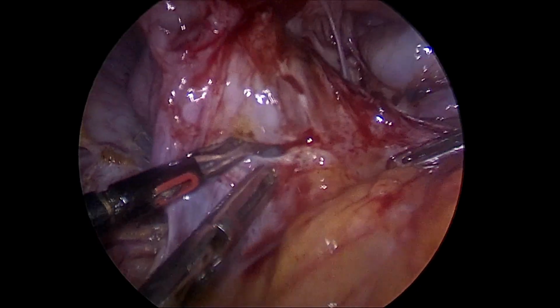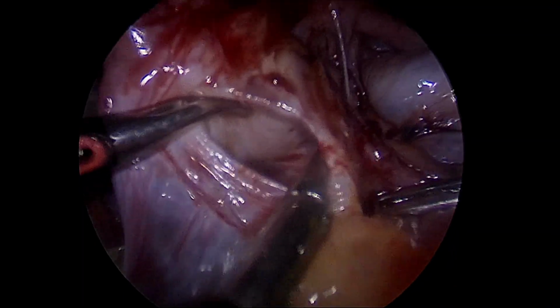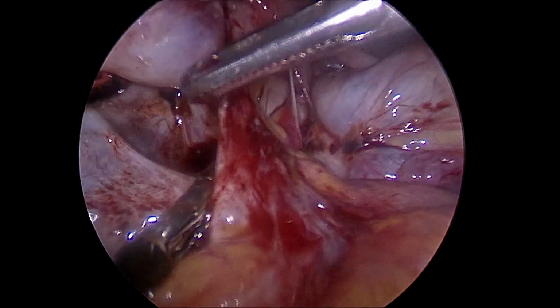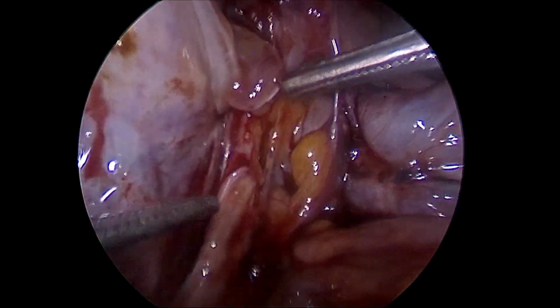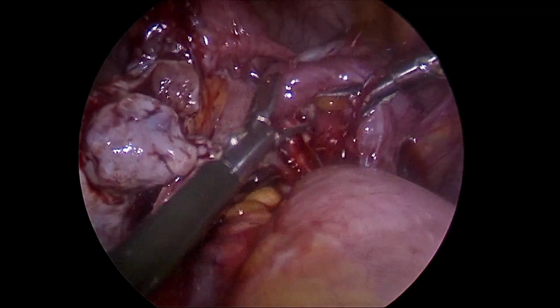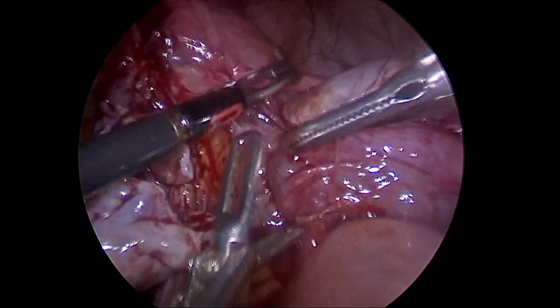As we see, after separating the bowel from the lateral pelvic wall, we go to the region of the left tube and the ovary where we find the natural windows through which we do a blunt dissection and separate. When the left ovary was separated, we can see hemorrhagic blackish chocolate brown fluid coming out, and that was separated and the ovary was retained in its normal position.